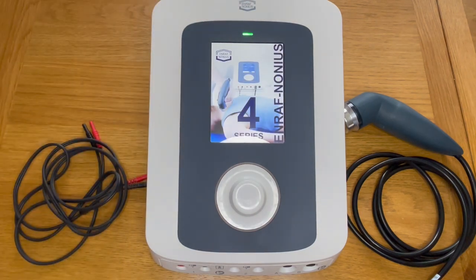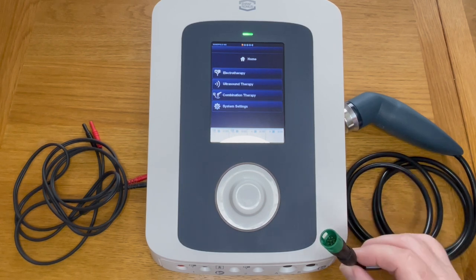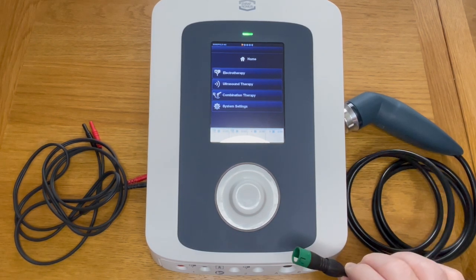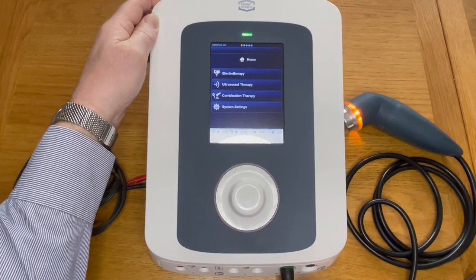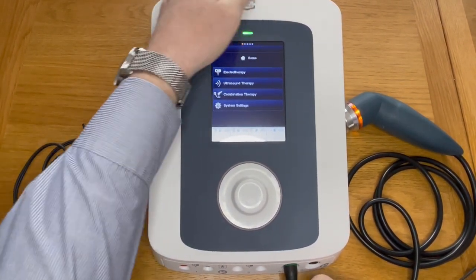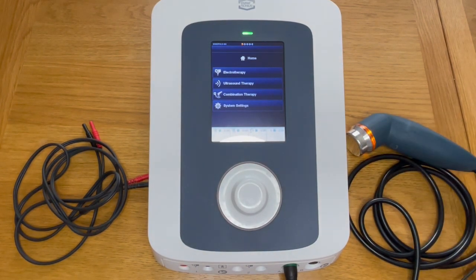The unit comes on and does its own self-test. Once the self-test is complete, you can choose to plug in your ultrasound head and your electrode cables. The ultrasound head has a green connector and will fit into either the A or B socket. As soon as it enters, you can see the orange light will come on the ultrasound head to tell you it is connected.